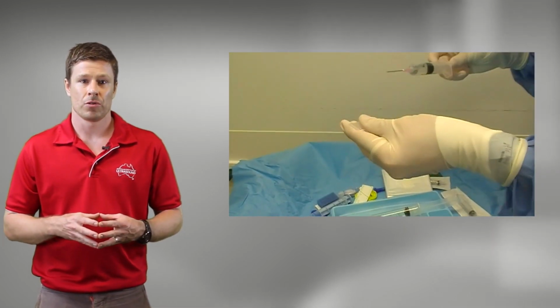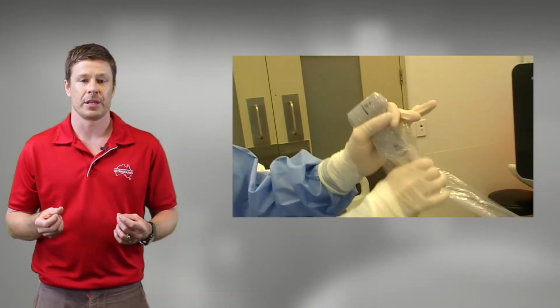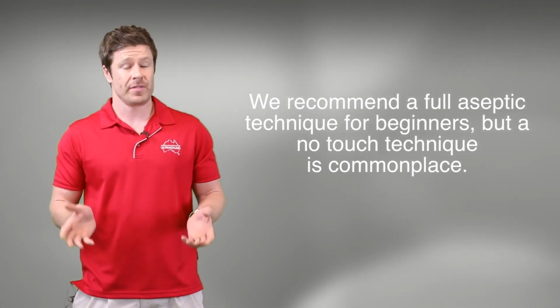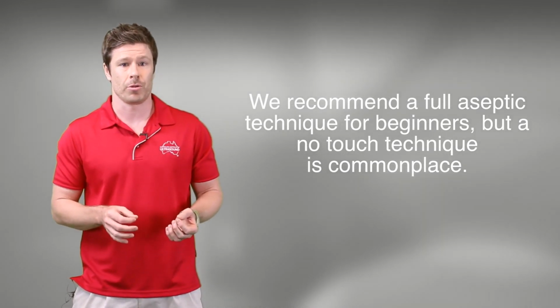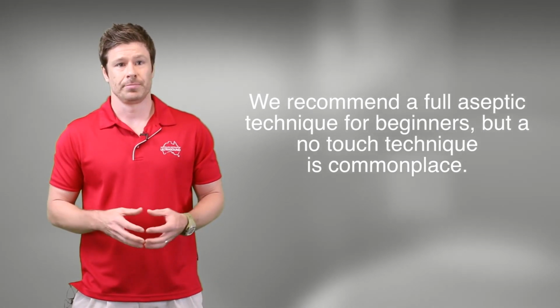With sterile gloves on, draw up your local anaesthetic and place on your dressing tray. Put the sterile probe cover onto a high-frequency linear array probe. In principle, a no-touch technique can be used. However, a probe cover is recommended as the needle enters the skin very close to the ultrasound probe. For demonstration purposes, a full aseptic technique has been used here.